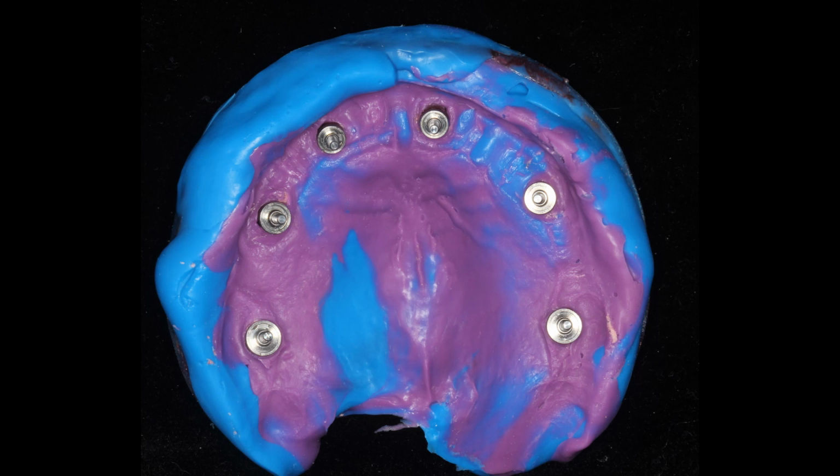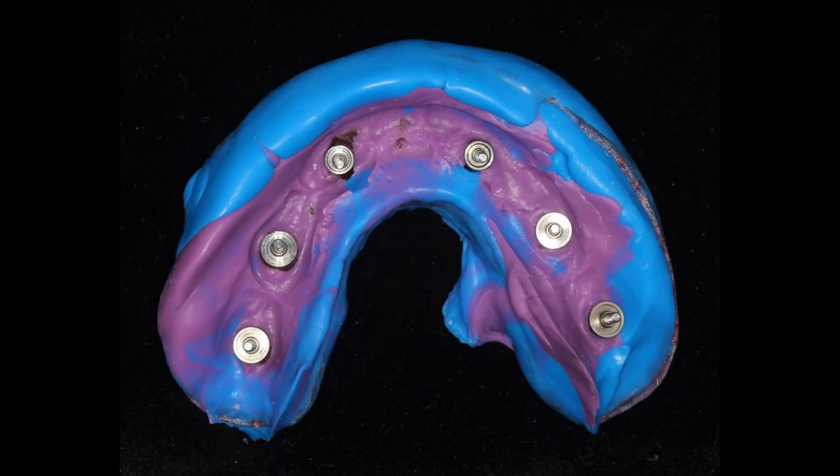This is the final impression. It picks up that red jig that we showed you on the last slide. So these impression copings give us the implant position, and the purple and blue material show us all the soft tissues. We need both of those to make a proper fitting prosthesis. The same process on the lower is shown here.